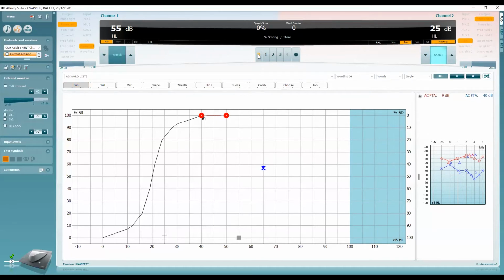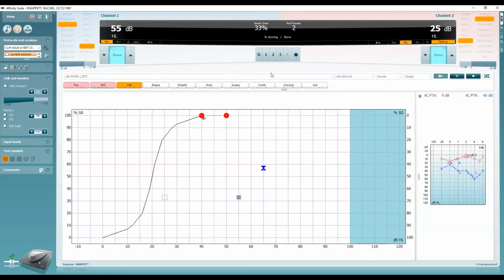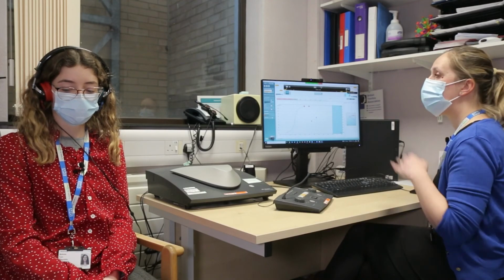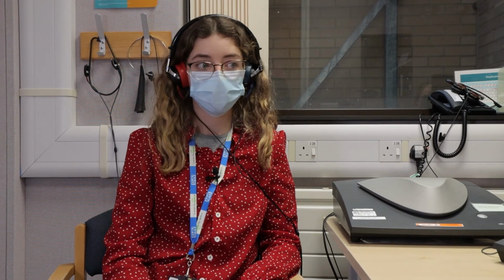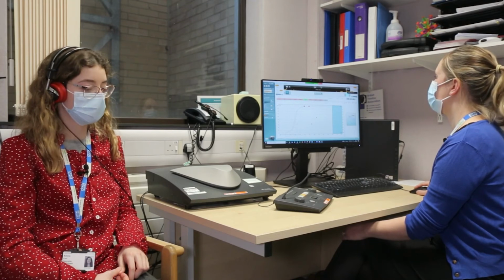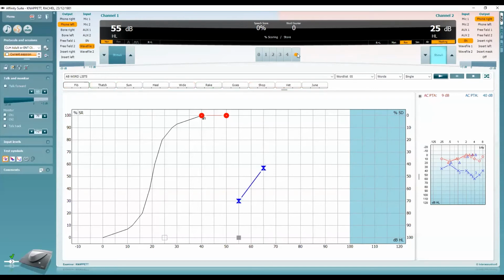Can't hear it. Mill. Okay, doing well. Mat. Couldn't tell. No, that's fine. Keep guessing if you're not sure. Any sounds that you hear will count towards your final score. Can't really hear it. Don't worry, well done. They were really quiet, those ones. So now my patient scored 30%. I'm going to store that.